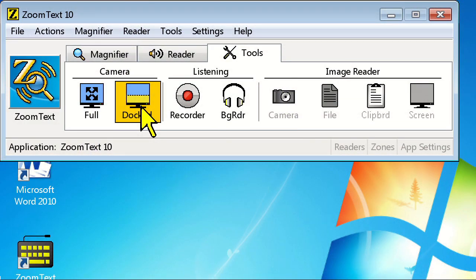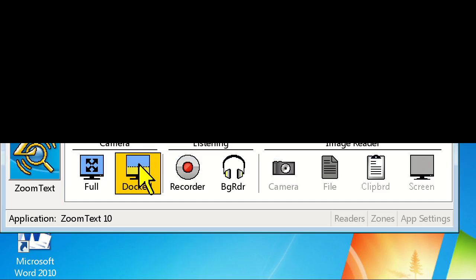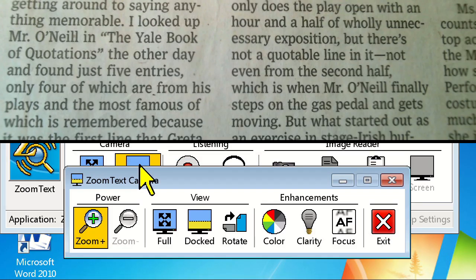Now that your camera is ready, let's click on the Dock button to take a look at the split screen view. Here we can see what our camera is looking at on half of the screen, and on the other half, simultaneously view our desktop with ZoomText. Notice that a new toolbar opens, allowing you to control the camera.